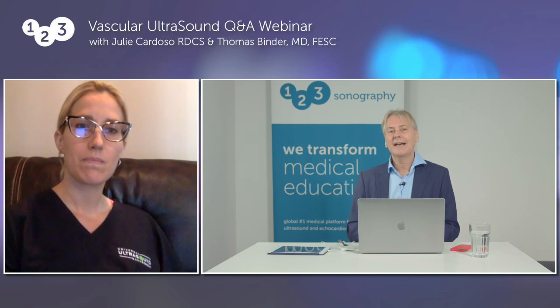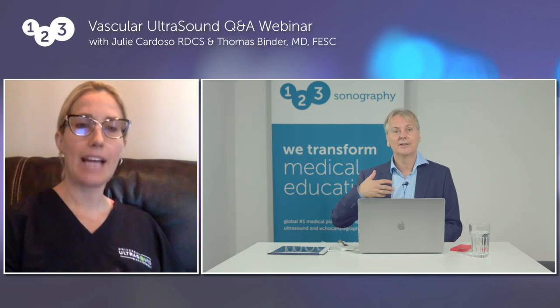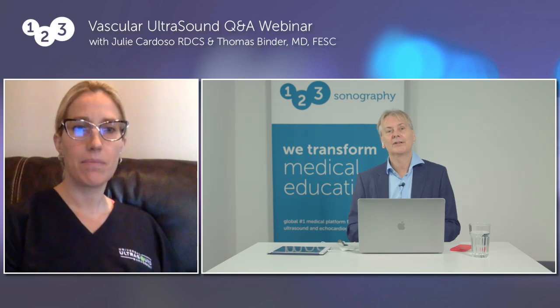How often do you have a patient where you have the suspicion that they might have pulmonary embolism? And it's very nice to just use a different transducer on a different part of the body, and you can actually find the cause of that as well. And there are so many connections, like coronary artery disease and the carotids, for example, or aortic dissection, and seeing if the dissection membrane goes all the way up to the carotids.